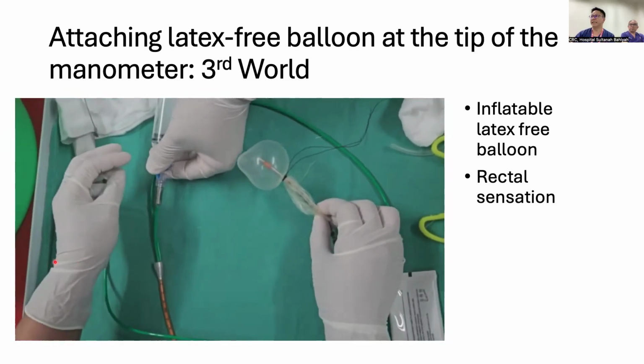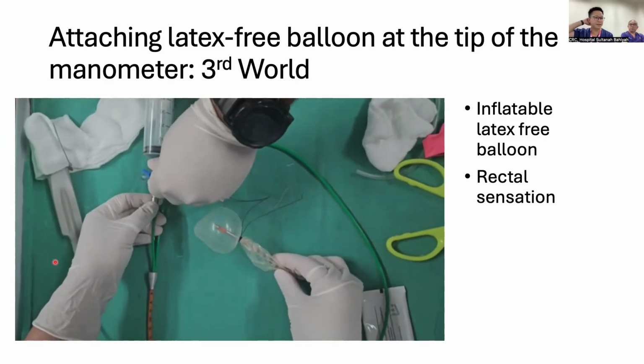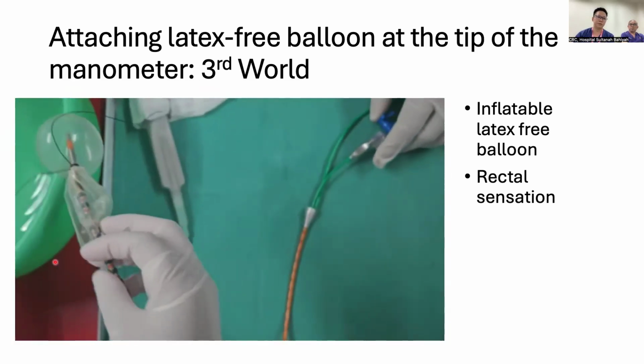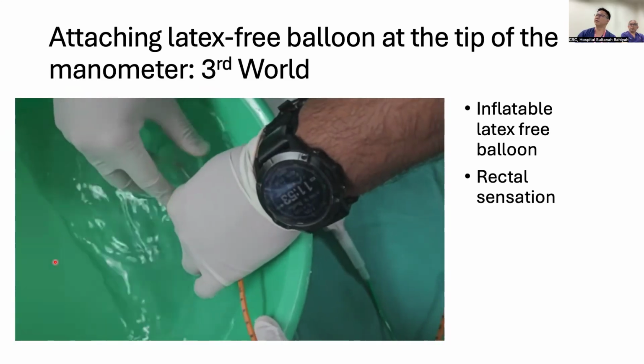Not only do you want to tie it tight, you also want to test it. We do what we call the underwater test. We put it inside a tray of water to see if there are any bubbles. And a negative bubble test means that me and Hizami have done a very good job.